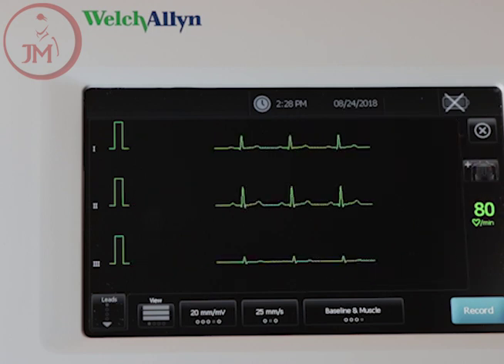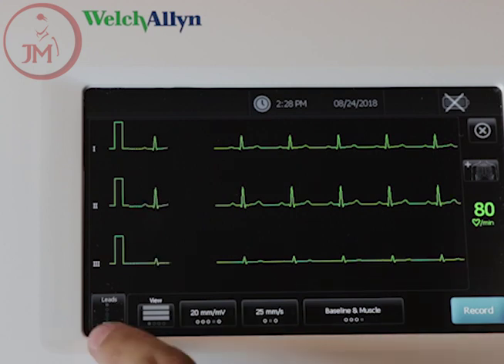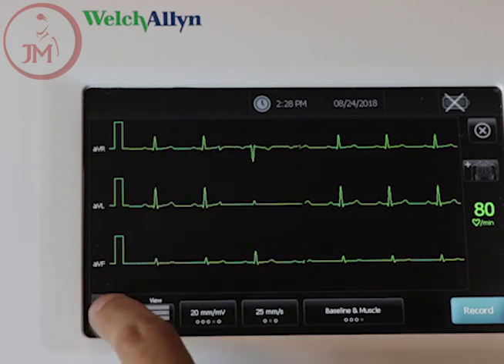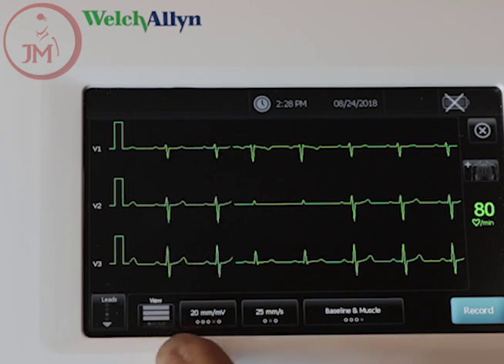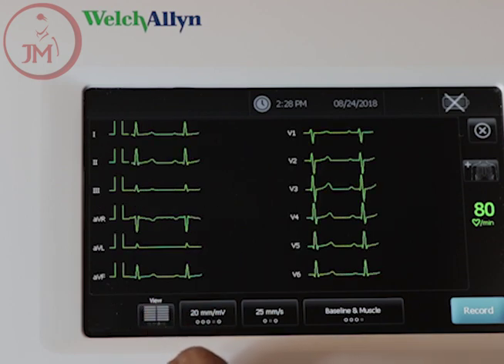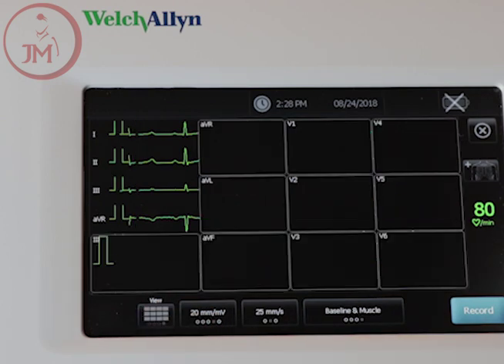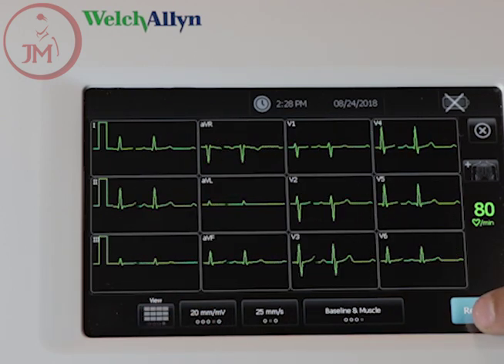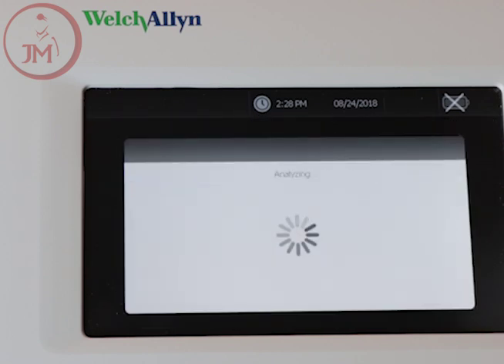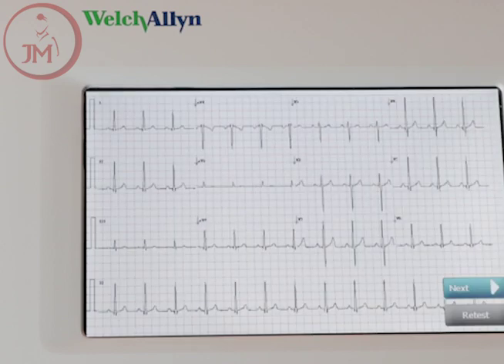From here, before you take your 12-lead, you can cycle through the leads or you can change the view. Once you're ready to take your 12-lead, all you do is press record. You then have a chance to review the ECG before you actually print.